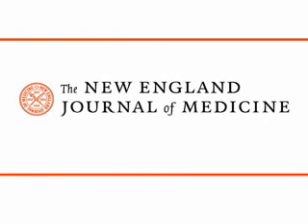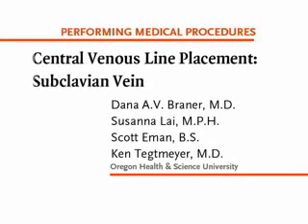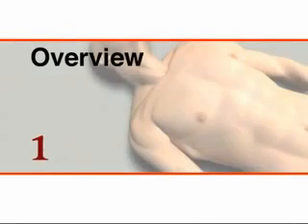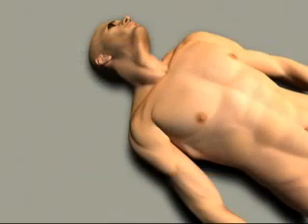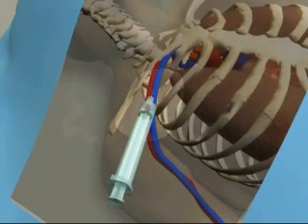This is a video in clinical medicine from the New England Journal of Medicine. Evidence suggests that the risk of major central venous line complications, particularly line-related bloodstream infections, is lower when the subclavian approach is used. This video will identify the landmarks and procedure for placement of a subclavian central line.